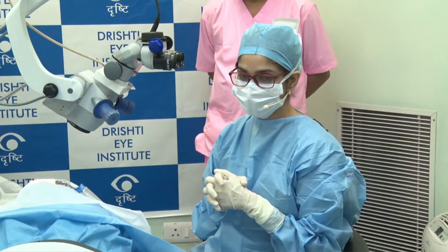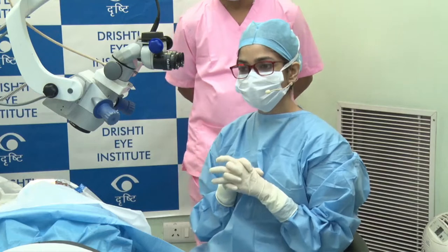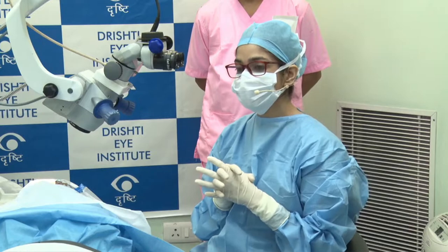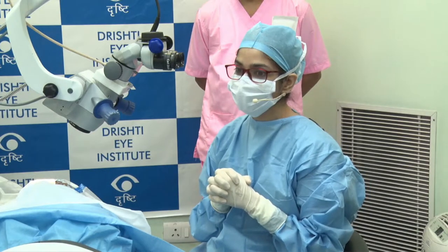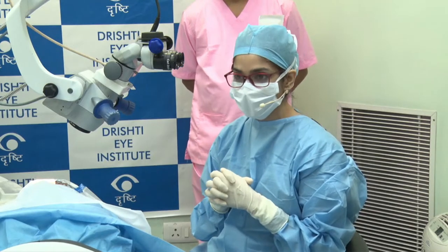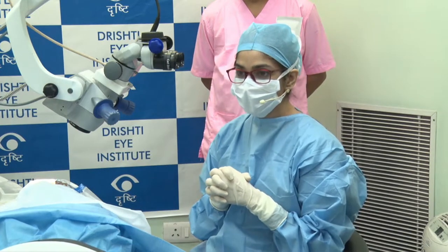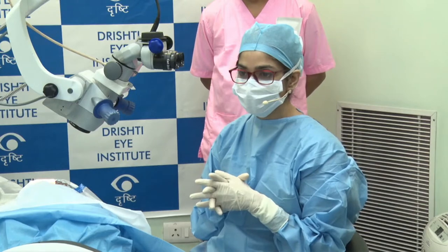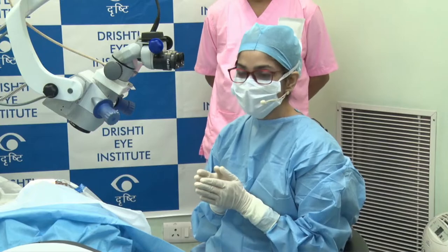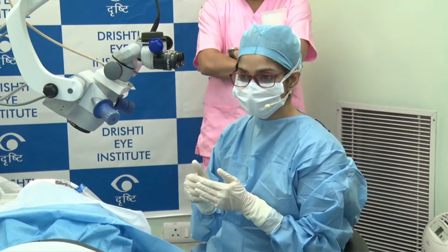Madam, could you please tell us the reason why you prefer it over the normal trabeculectomy? Sir, the indications for both are completely different. The patients in which I would do an eye stent are the ones where I would be scared to do a trab, or I would like to defer the trab for patient reasons or my own reasons. For example, young patients who have a medicated IOP which is uncontrolled on 2 AGMs or so, rather than giving them the option of only trabeculectomy, this is one thing that you can try.